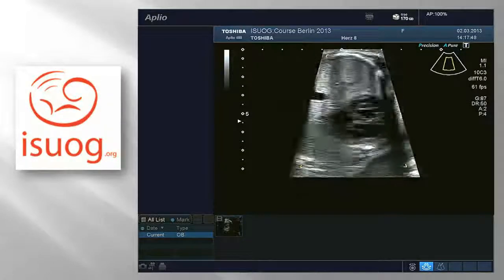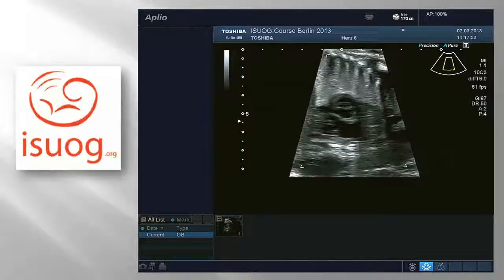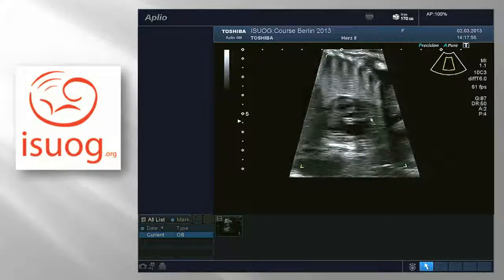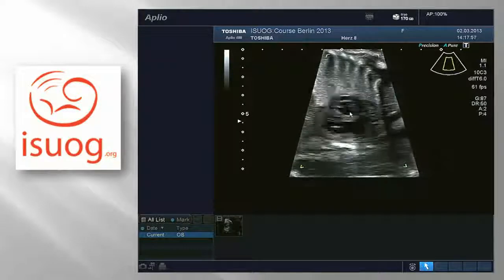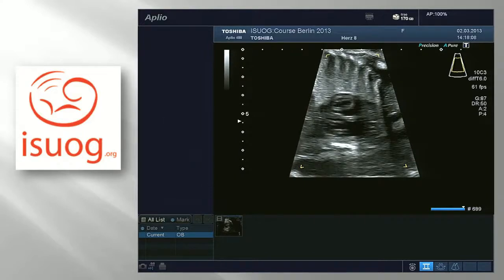And from here, just rotating to a cross-section through the ventricles. You see a short axis here through the mitral valve. That comes actually quite pertinent to my talk afterwards, because we see a normal mitral valve, which is a bileaflet structure. You can see it opening like a fish mouth, close, and open, and close, because that is a key thing sometimes if you want to differentiate from an AV septal defect.